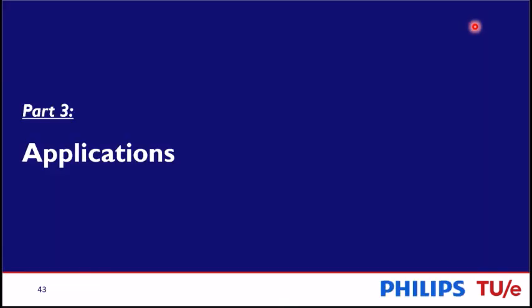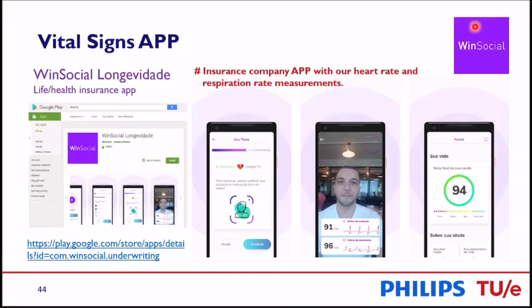Now we come to part 3, applications. I will mainly introduce two applications. The first is the VitalSign app, and the second is the VitalEye. The VitalSign app is co-developed between the WinSocial insurance company and Philips Research, where they used our vital signs measurement techniques as a built-in function to measure the subject's heart rate and respiration rate as a kind of pre-screening. If you're interested, you can download it at the Google Store and play around.